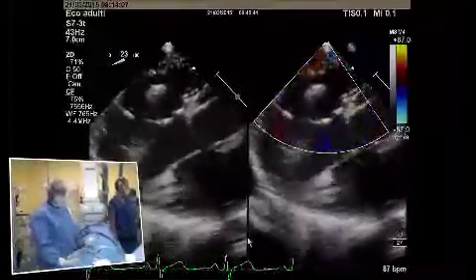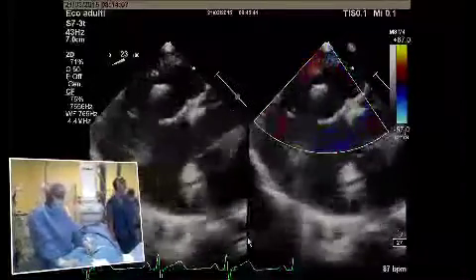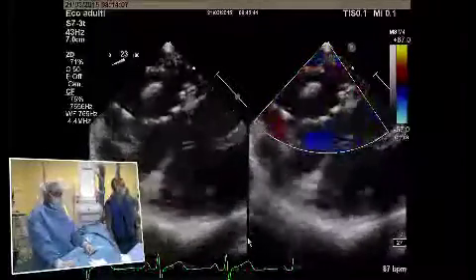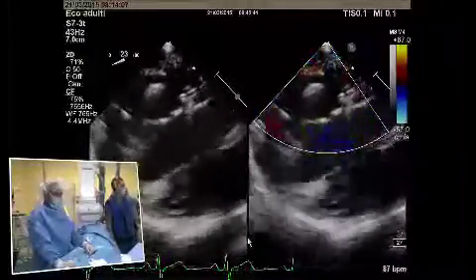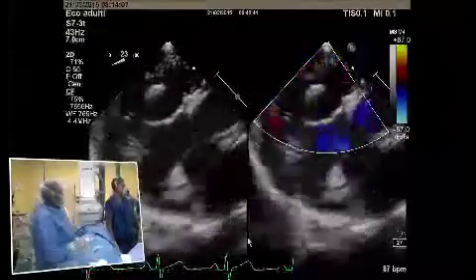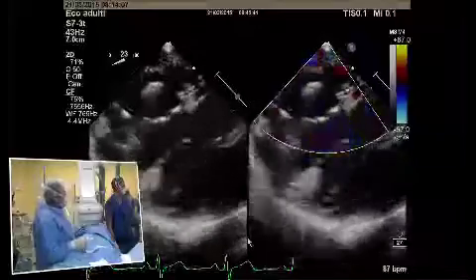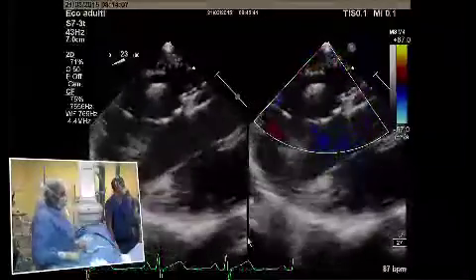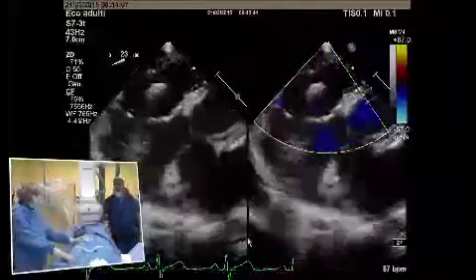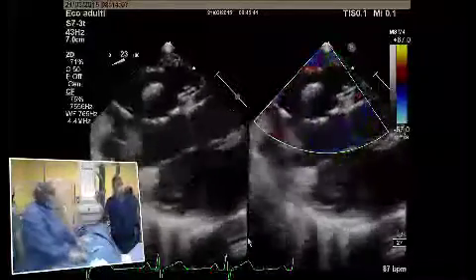I have a question to Aki, if he can answer me. On transthoracic, it seems that the defect is larger than it looks in the TEE. Did we look at the IVC and the inferior rim completely on a sweep? Or does Aki think that it's only a single defect? I think it's a very good question.